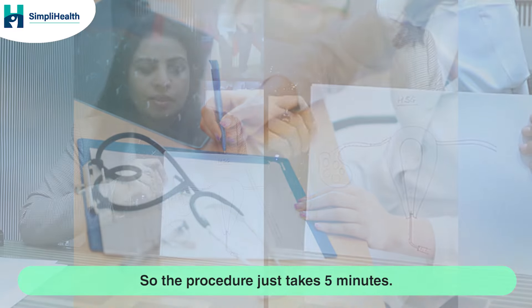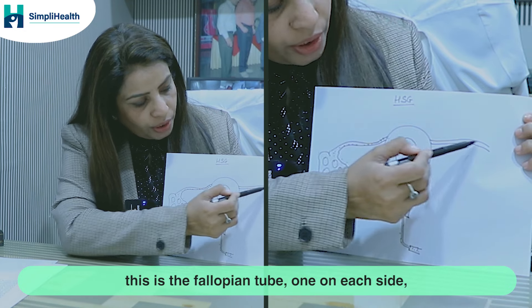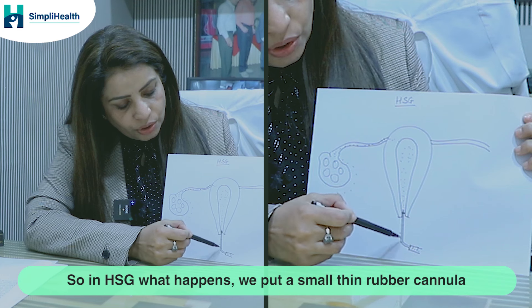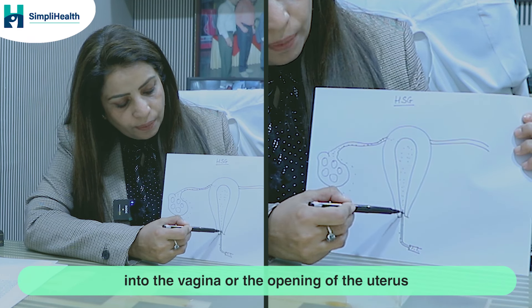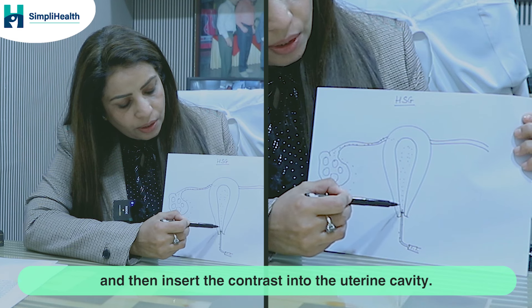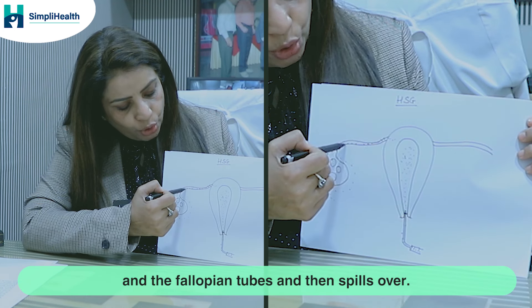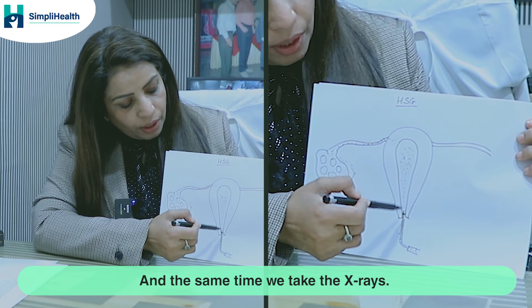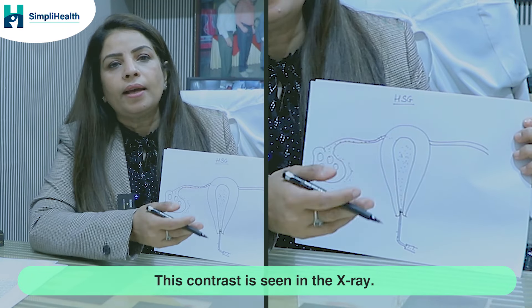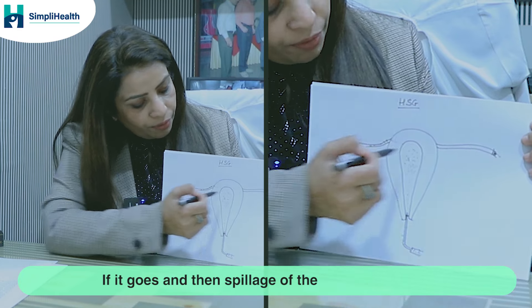The procedure takes just 5 minutes. This is the uterus, this is the cavity of the uterus, these are the fallopian tubes — one on each side — and this is the ovary which has multiple follicles that release eggs. In HSG, we put a small thin rubber cannula into the vagina or just the opening of the uterus, then insert the contrast into the uterine cavity. This fluid-like contrast travels into the uterine cavity and the fallopian tubes, and we take x-rays simultaneously. If the contrast is only seen up to a certain point, that means the tube is blocked at that level.